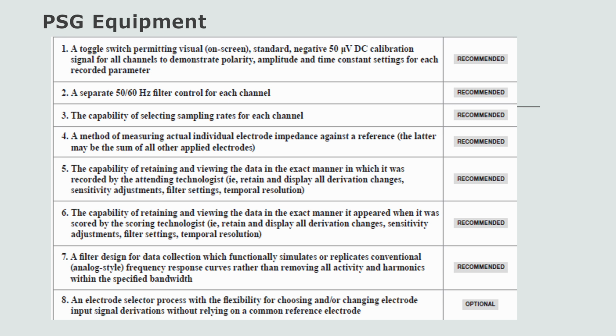These are some of the bare minimum requirements for the sleep software and computers you have to use to be an accredited sleep lab. Up-to-date sleep software typically already has all this included, but most labs using software have to be AASM certified, so they most likely come ready to be used. Most likely these recommendations won't be plentiful on the exam, but there might be one or two. Talking about notch filters, the 60 hertz filter, the sampling rate has to be a certain rate.